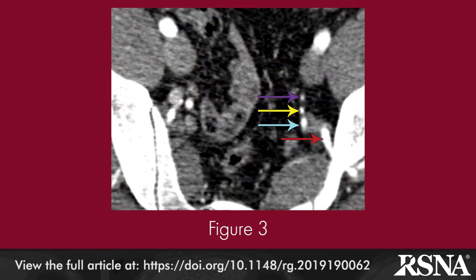Figures three through eight demonstrate these arteries and their vascular territories as seen on CT pelvic angiography. An axial CT angiogram at the level of the greater sciatic foramen shows localization and visualization of the four major pelvic arteries. From anterior to posterior, they are the obturator (purple arrow), internal pudendal (yellow arrow), inferior gluteal (blue arrow), and superior gluteal (red arrow) arteries.